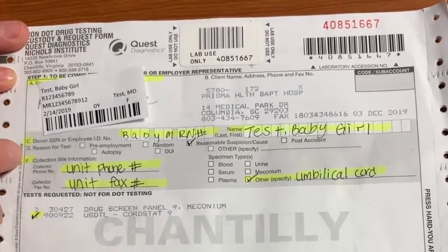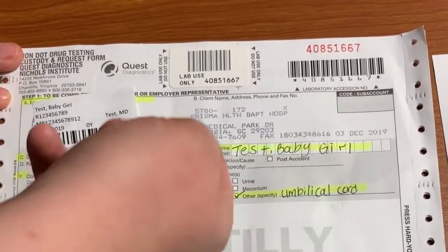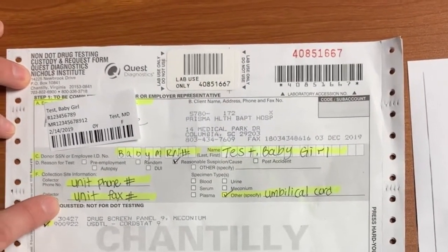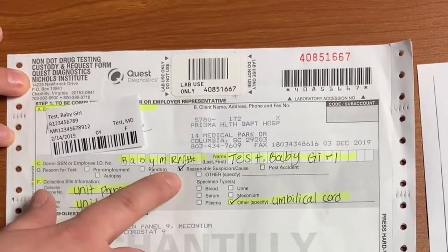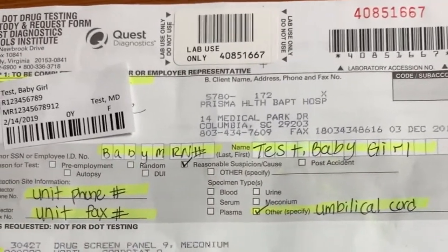Then you're going to fill out section C, and it's going to be baby's medical record number, and then you'll put in the baby's last name, baby, and whether it's a male or a female. F is your unit phone number and unit fax number, so that will vary by location. You'll check for reasonable suspicion or cause, and then select other and write in umbilical cord.